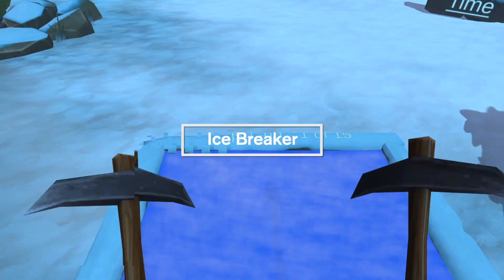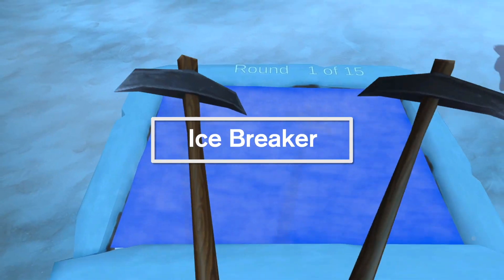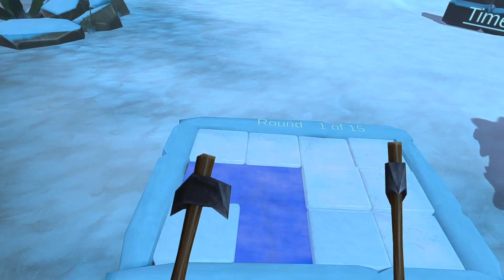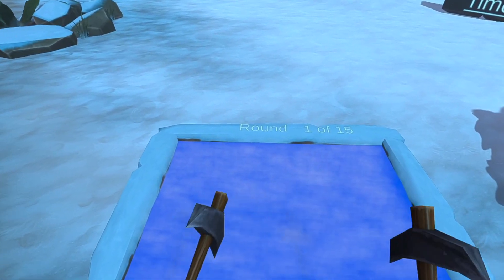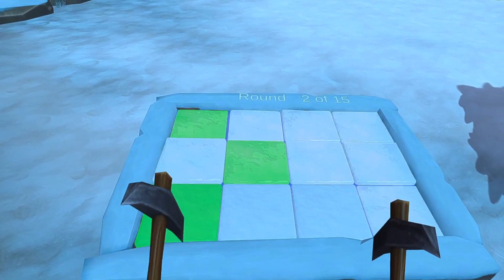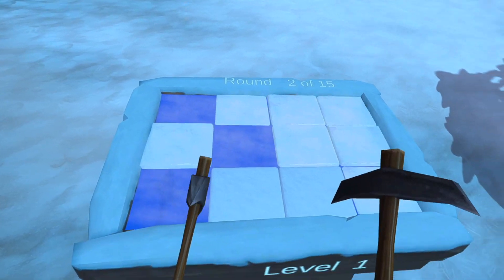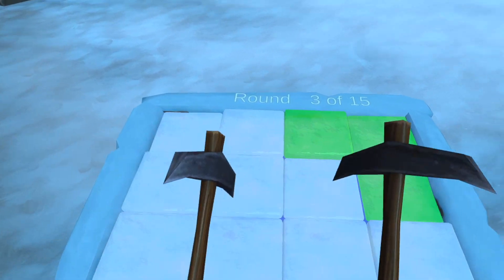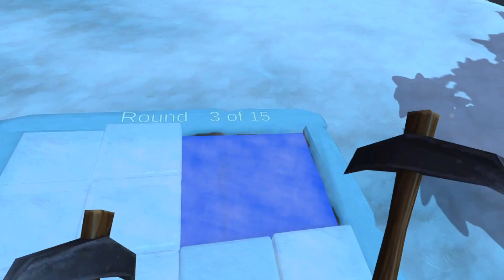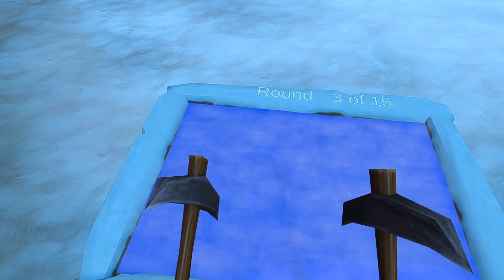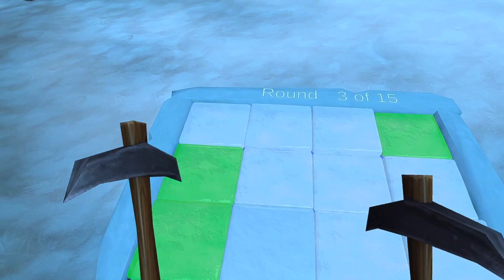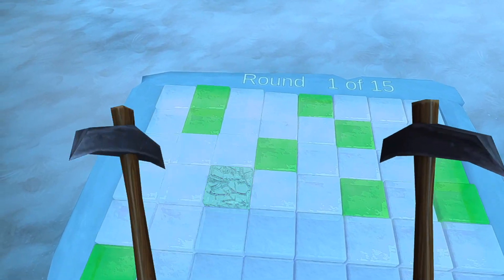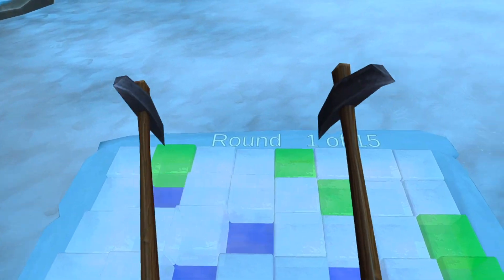Next we have Ice Breaker. This is another eye-hand coordination activity. The objective is to hit all the green ice cubes as they spawn out of the ice bath. The better you perform each round, the smaller the ice cubes get. The difficulty settings will decrease the size of the ice cubes.